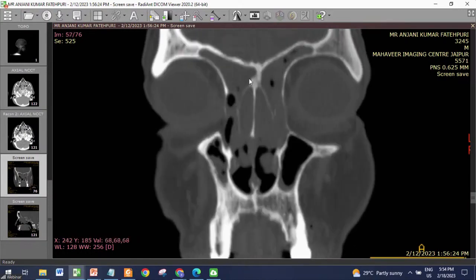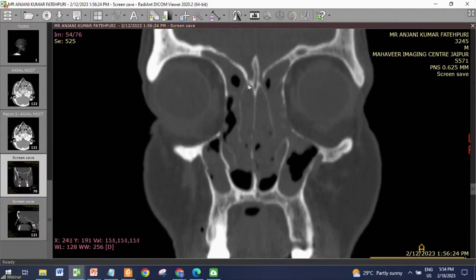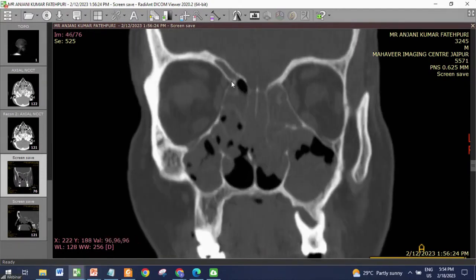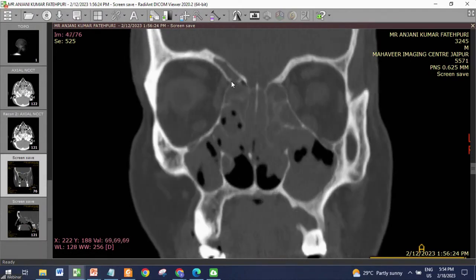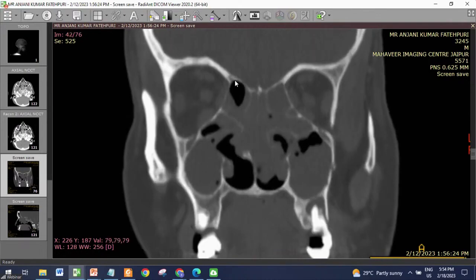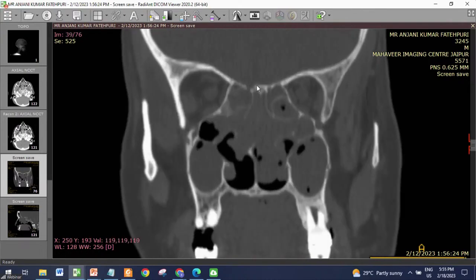The anterior ethmoidal roof has come. See, I am going behind the anterior ethmoidal roof. Cribriform is there. Coming behind. Now behind is the anterior ethmoidal artery. See how far behind it is. Got my point? Yes, sir. Frontal sinus, the beak has gone. This is more than a centimeter behind the beak. Don't be terrified. And now once the artery is gone, see the posterior roof starts.